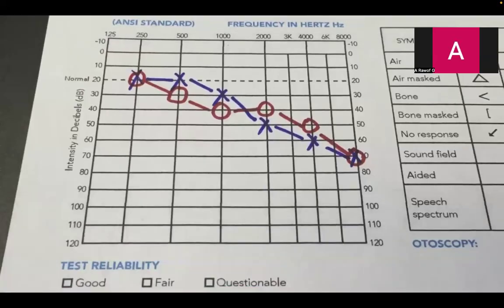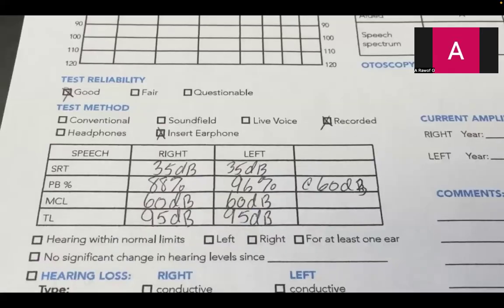More often than not, a hearing loss isn't found solely in one of these zones, unless they have what we call a flat loss. Typically, a loss may start in one zone and go through another, or two, or three zones, or even more. This box is used for your speech test results. These tell us things like what's the quietest you can make out words, and how many words do you catch when the volume is at the level you're comfortable at.